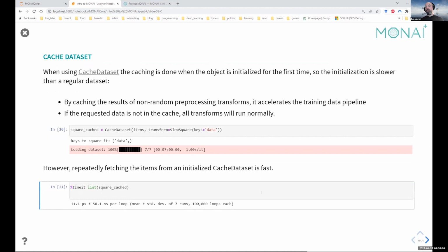Now, obviously, this is not a realistic example. Realistically, you will expect to have some randomization in your pipeline. And in the real world, even if you've got a resampled data set that's in a very efficient to load format, it still has some cost to fetch it. In the case of caching, it doesn't, because everything's held in memory. So provided your data set is small enough to be held in memory, then you're not incurring the cost of loading at all. Although you can specify a budget for the cache.